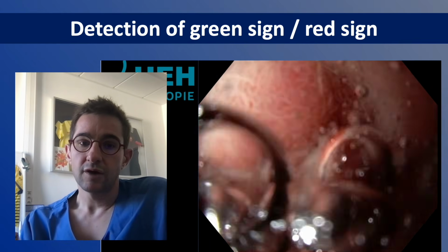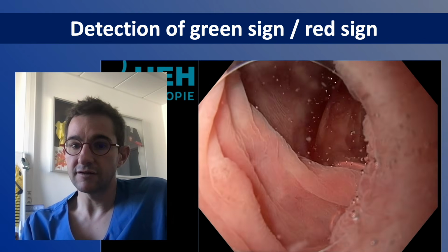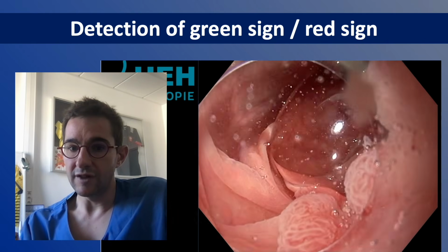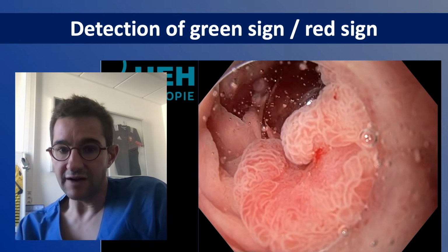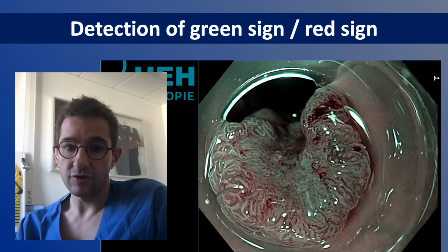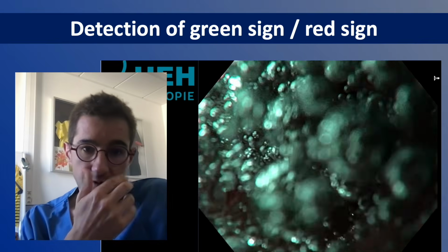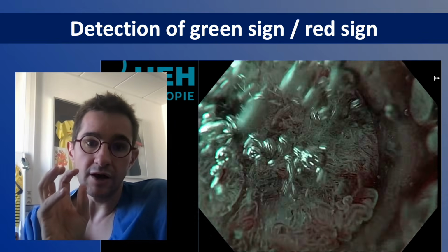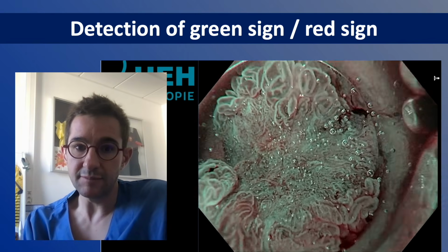examination. It was a granular LST with a large nodule addressed for ESD with no malignancy detected, but once searching with the cap, you can see that in fact in one small area under 12 millimeters there was a T1 cancer located in this area with a very small area of destroyed pattern in the middle, less than 10 millimeters.